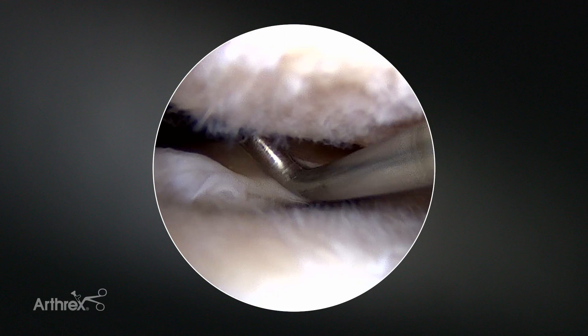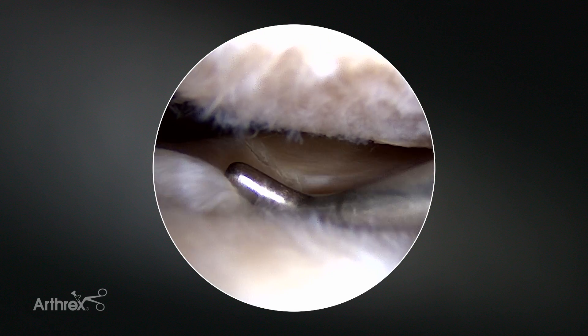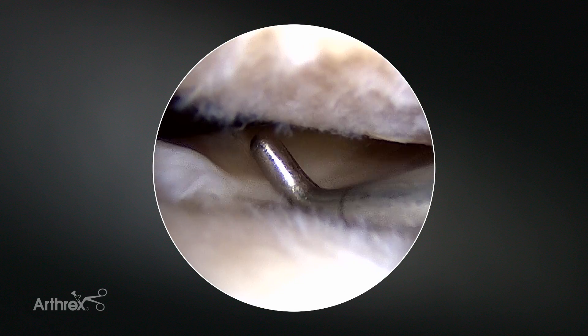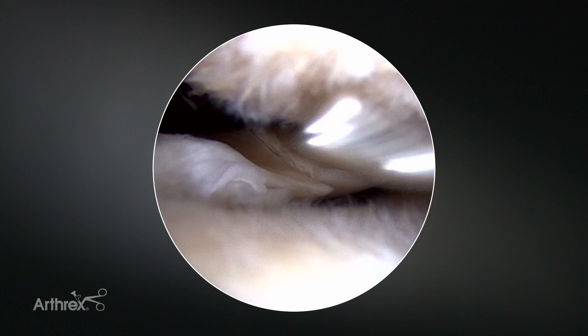So with this in planning, what we want to do is reduce this side to side, make sure we have it balanced, because these tears are very vascular and heal great. So we should never think about taking this type of tear out.